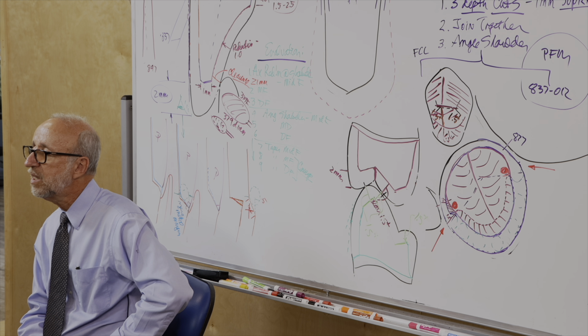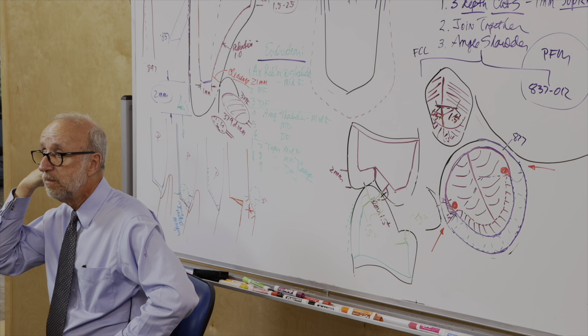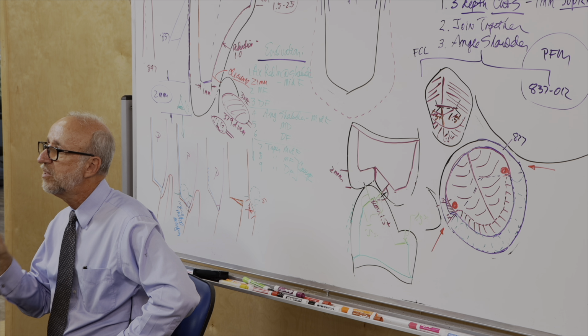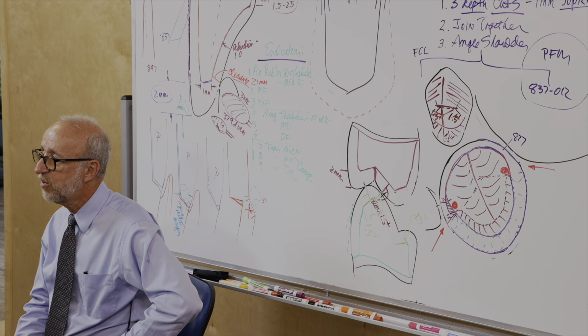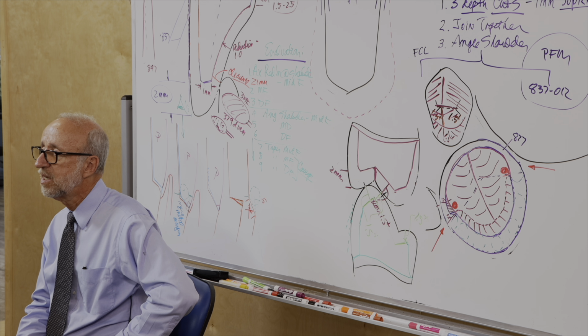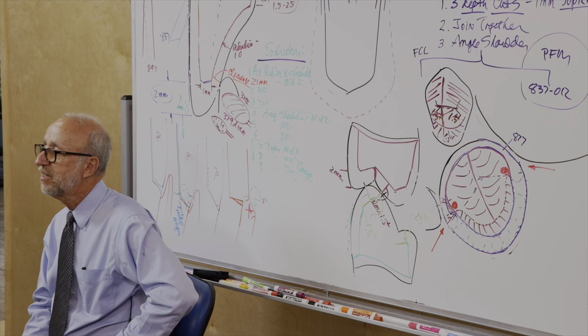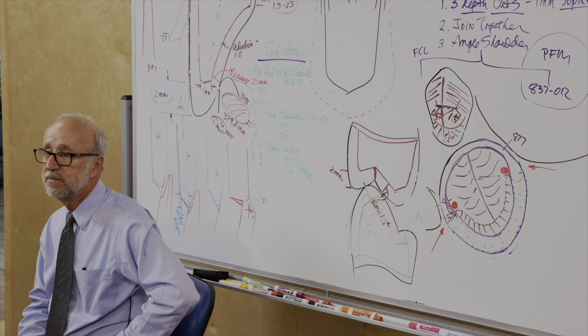But the lower lingual is the only wall that we may not need a secondary plane for, or we probably don't ideally. Okay? Other walls we might not if we over taper and make a mistake. But if you do everything right, the lower lingual, probably with any taper at all, you don't need a secondary plane. So there is one for the upper molars, right? On the facial and the lingual.